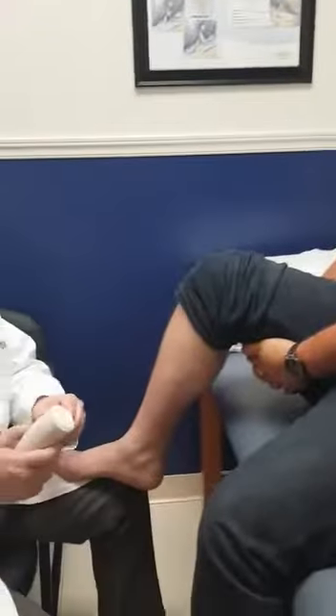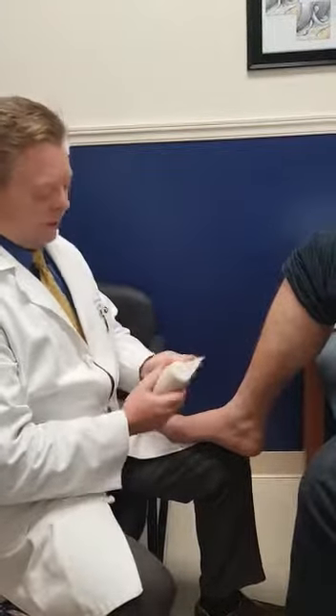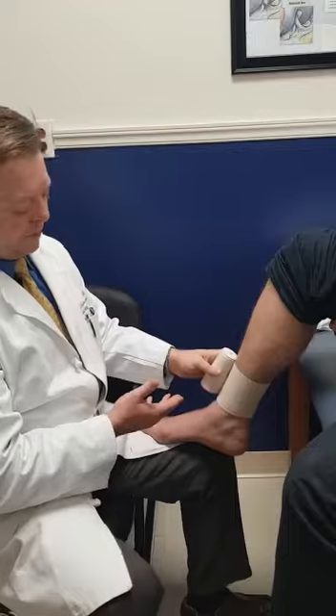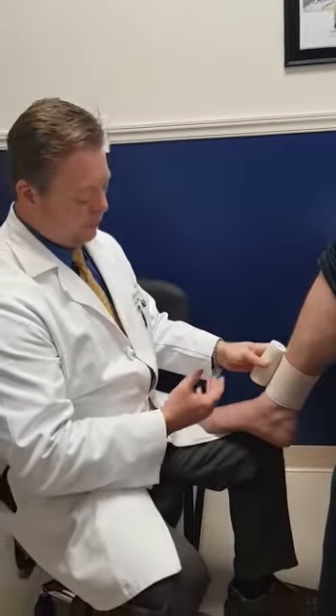We're going to teach you how to wrap an ankle. I like to start at the top of the ankle and usually I do two wraps here. You can use this for many things — instabilidad, dolor, you can use it for inflammation.